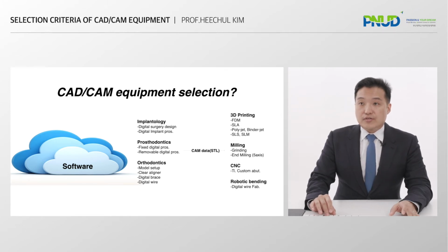Personally, I purchased 3Shape software for orthodontic treatment about 6 years ago, and currently I treat my orthodontic patients digitally using the converted STL files.